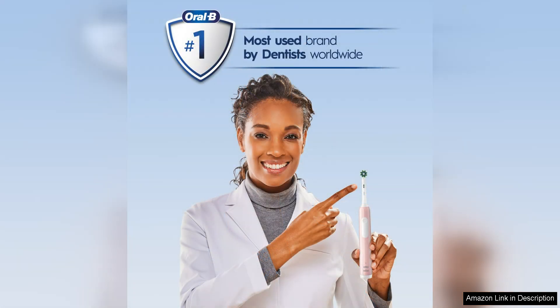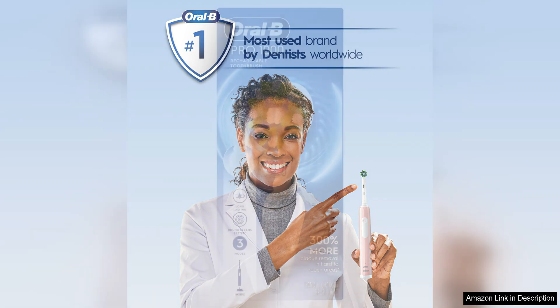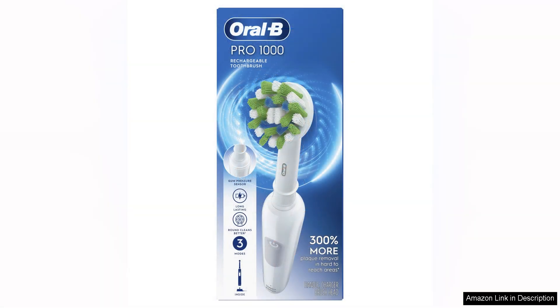One downside of the Oral-B Pro 1000 is that it does not come with multiple brush heads or different cleaning modes, which may be a drawback for those looking for more customization in their brushing experience. However, the included cross-action brush head is designed to provide a superior clean, so this may not be a deal-breaker for everyone.